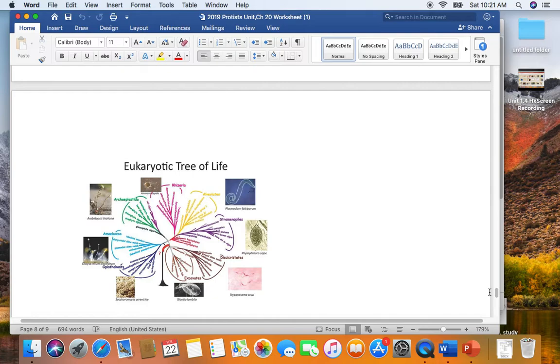One way to diagnose it is to take secretions from the urethra or the vagina and make a wet mount, and apparently these little guys will be motile. I've never seen them live. You can also do a stain, which is what we'll have as our demo scopes. They said you can also culture them, which I thought was kind of interesting. One of the recommended drugs was metronidazole, which we described previously for Giardia and Entamoeba histolytica infections.